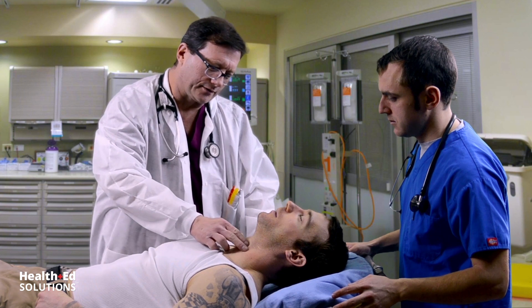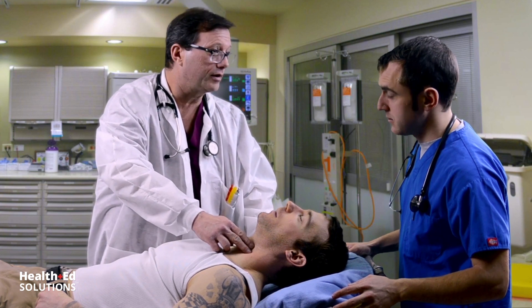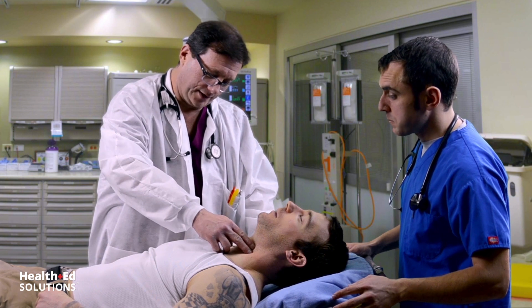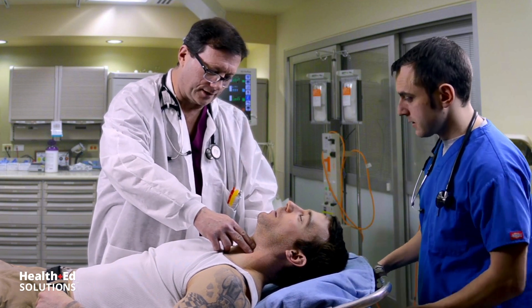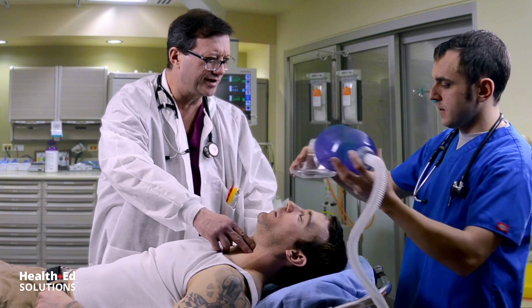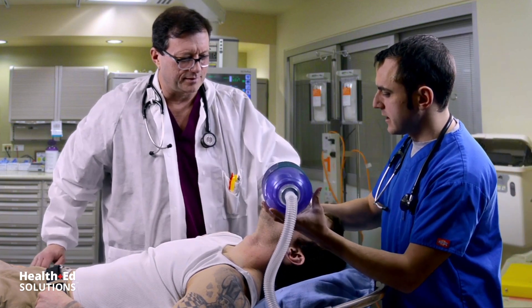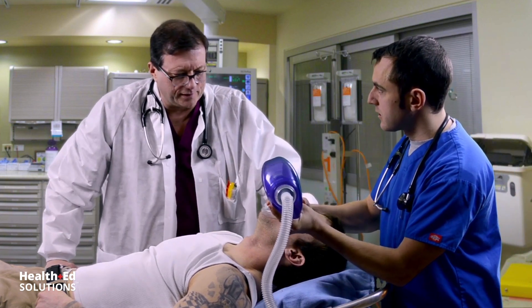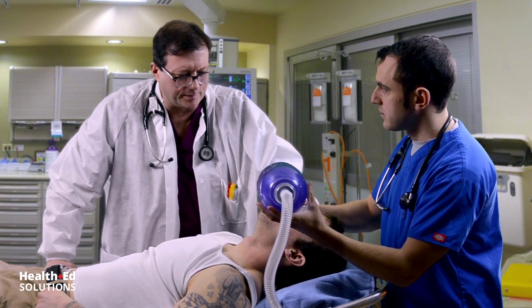Check for a pulse here. Got a good strong carotid pulse, but he is not breathing. Go ahead and bag this gentleman — start breathing for him. What's the rate? One breath every 5 to 6 seconds. We'll reassess for a pulse here in a couple of minutes.